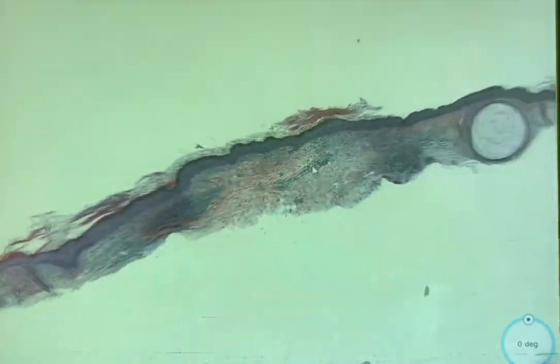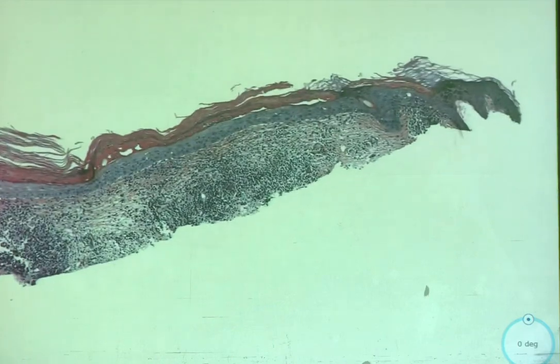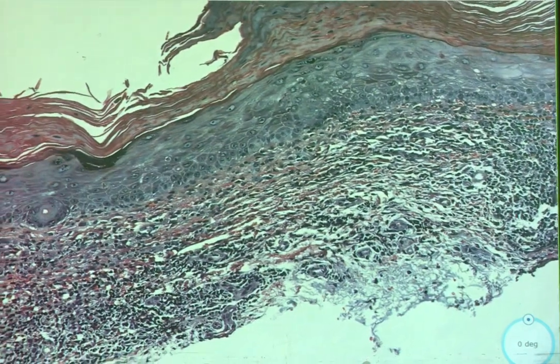Now I can also tell you that you have multiple pieces of tissue that you can look at. Yes. Remember, a good pathologist always looks at all pieces of tissue. And if worst comes to worst, that is why I am here. These are subtle lesions, but these are the kind of things that you have to spend time looking for. So you picked a good one, but a hard one to start off with.